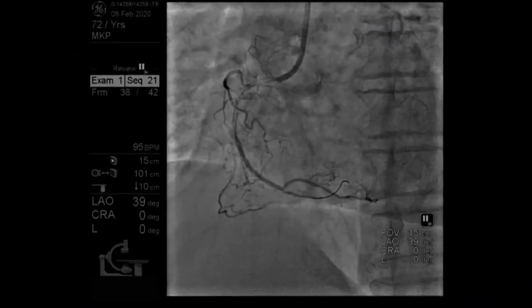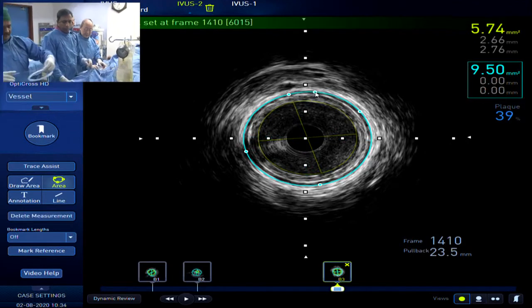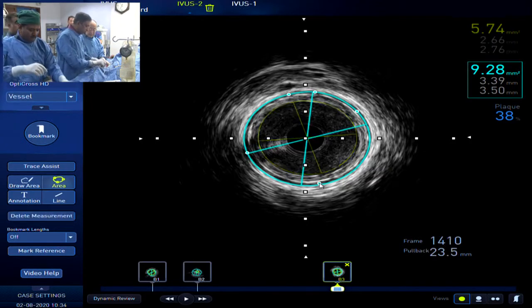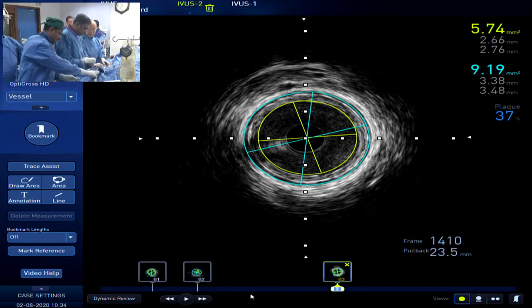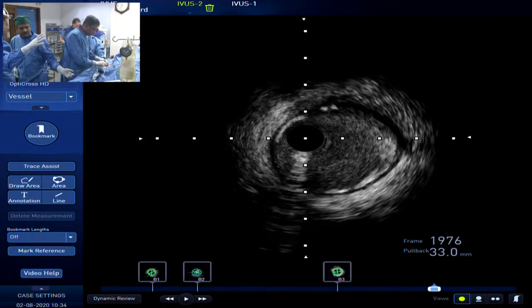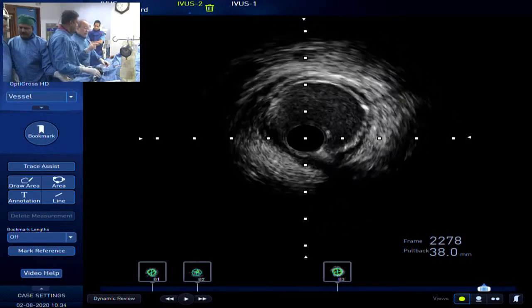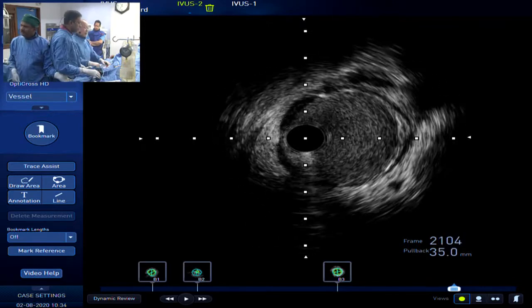Dr. Saito, I'm sure you use a lot of intravascular imaging, in this case ultrasound. With your CTO practice, with your risk of perforations and pericardial effusion, how often have you picked up the effusion with the intravascular ultrasound? First of all, we are not so much afraid of wire perforation. If it is limited to the guide wire, it's not a dangerous situation.